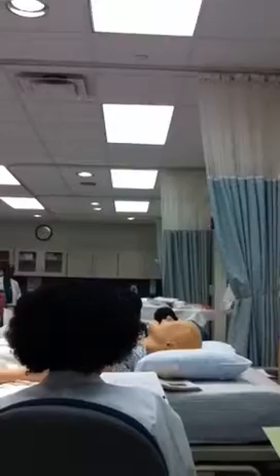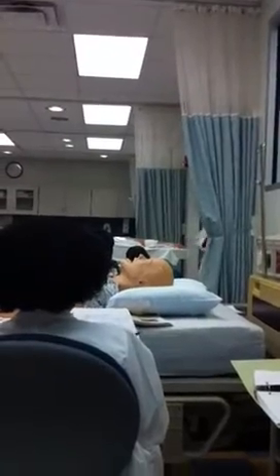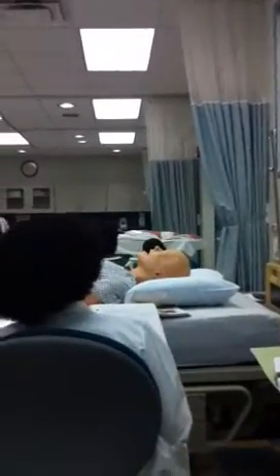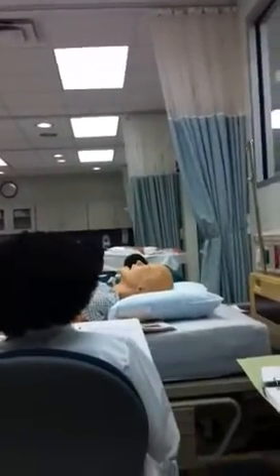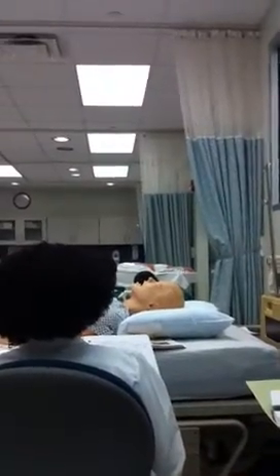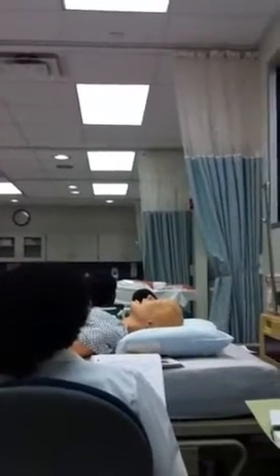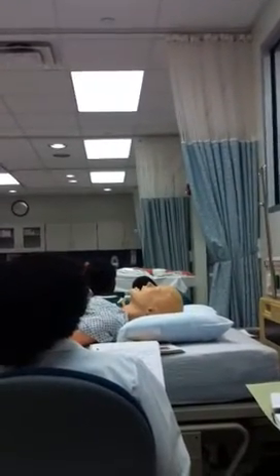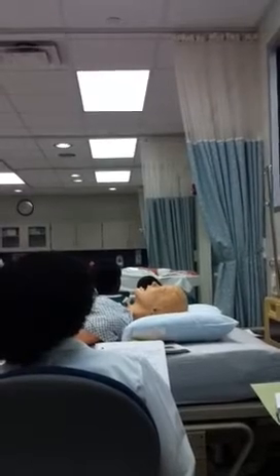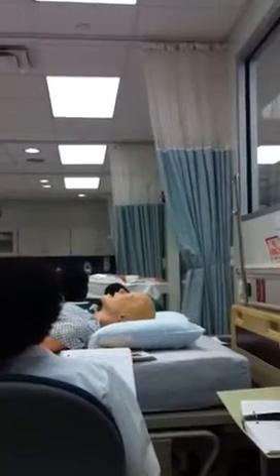Now, let's assume my insulin is right here in my medication cart. That's where it will be in the med room. What are the three things I want to check? Identifier, verification, expiration. Where's my insulin? Humulin N. Expiration. Humulin N. Right? First one, I've checked. Grab it.